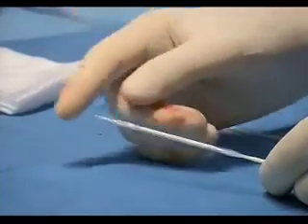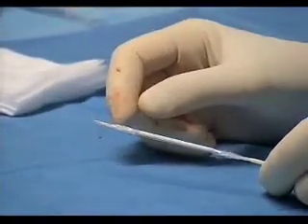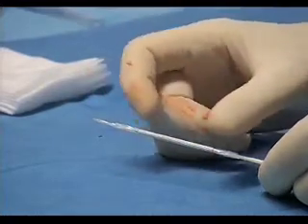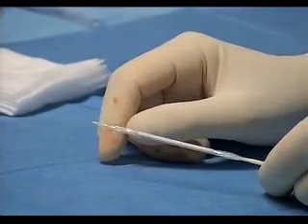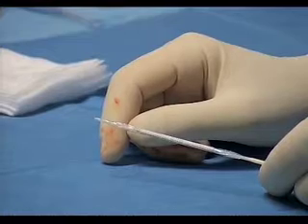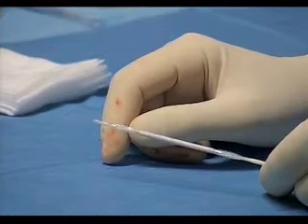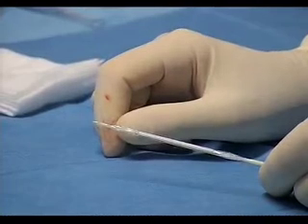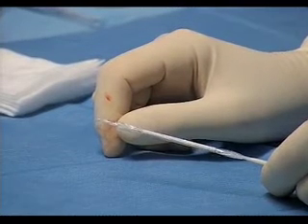We check the space that we have. Actually, we believe that 41 is the right length because, dilated up to 8 atmospheres in order to reach 12 millimeter diameter, we will get a length of about 35, 36 millimeters.